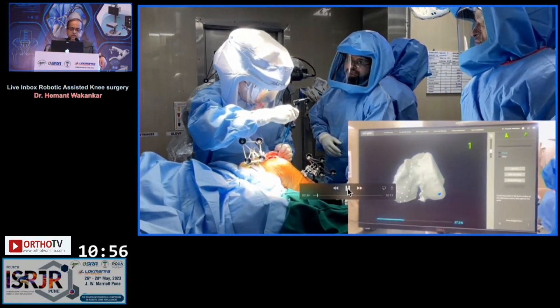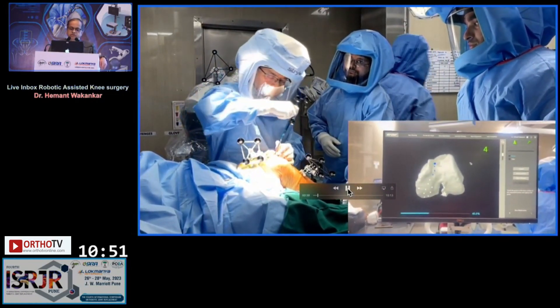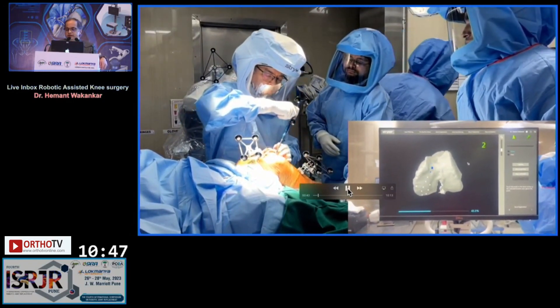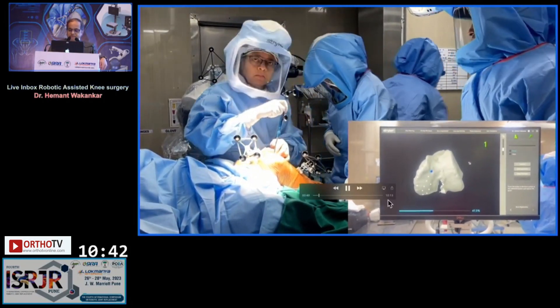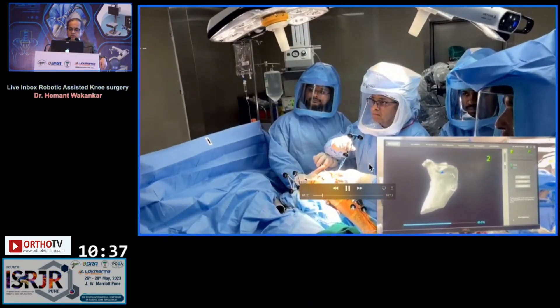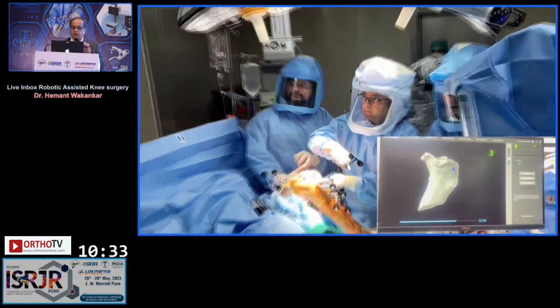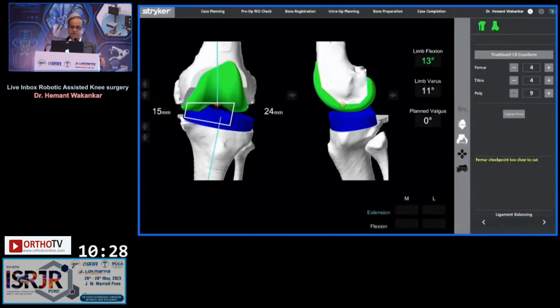On the femoral side we register about 30-odd points, and similarly on the tibial side as well. So we go through this process of landmark registrations, with various points taken both on the femoral side and on the tibial side. These are the landmarks being registered on the tibial side. After these registrations are made, we register what is the native anatomy. You can see it is 11 degrees of varus and 13 degrees of flexion deformity.